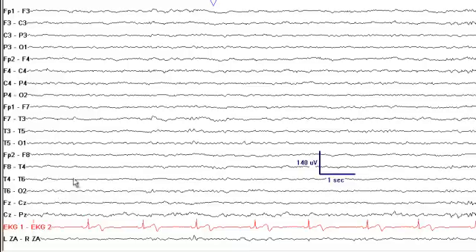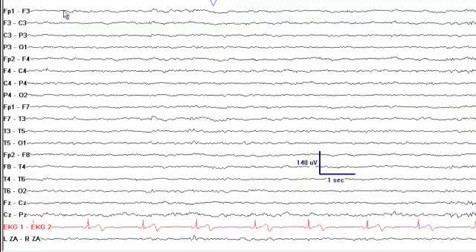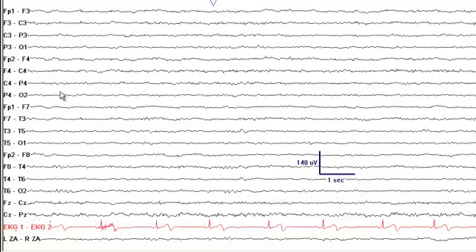The first thing you see on the EEG is a lack of occipital dominant alpha rhythm. Looking at O2 (right occipital) and O1 (left occipital), you do not see an alpha rhythm. You also do not see eye blink artifacts, which are typically seen in the frontal head regions at Fp1 and Fp2. So you can assume this patient is asleep. On this first page, there are no sleep spindles, so this is most likely stage 1 sleep.